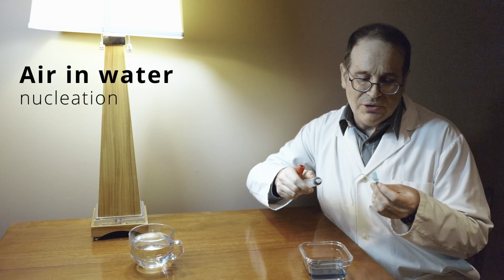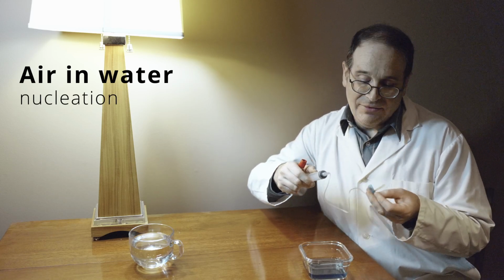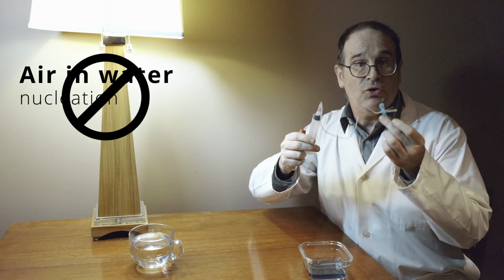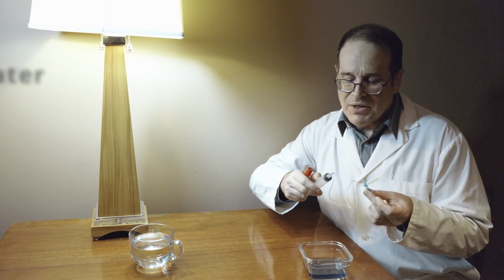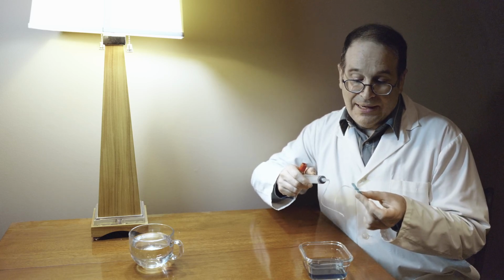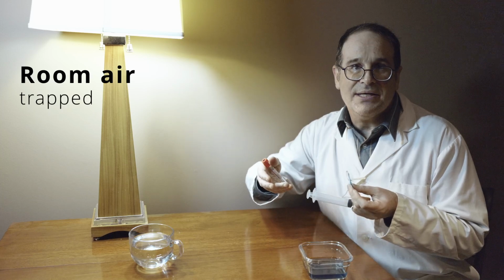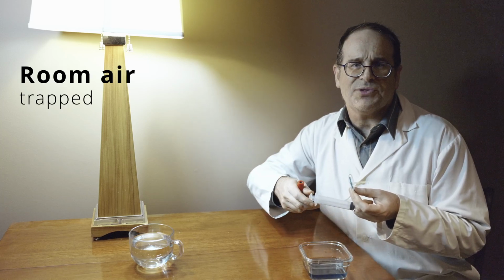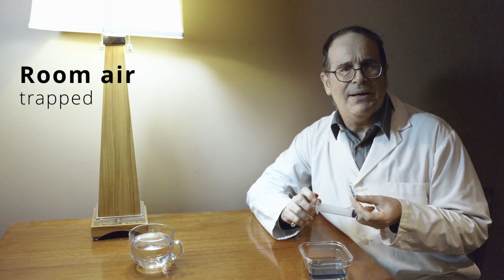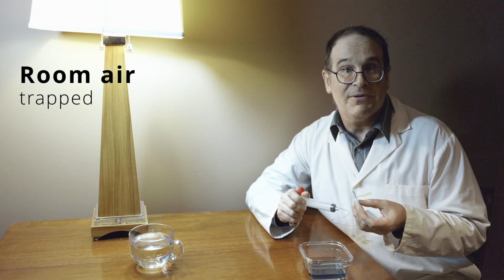Well, perhaps it's nucleation sites on the tubing itself which are causing the air in the water to come out. To test this, I basically used one of these butterflies, ran several hundred milliliters of water through it, and then applied a vacuum tube to it. What did I see? Almost no bubbles. So I think it might be part of the story, but I don't think this is the major part of the story. Where are these bubbles coming from? Where is that air coming from?